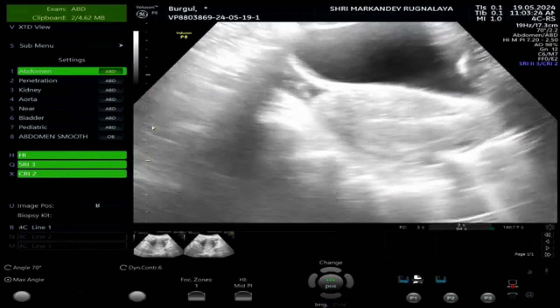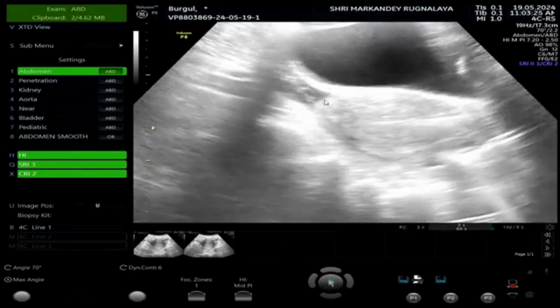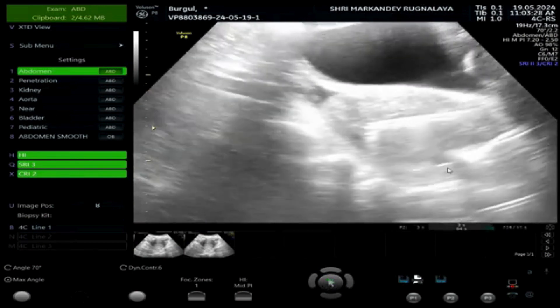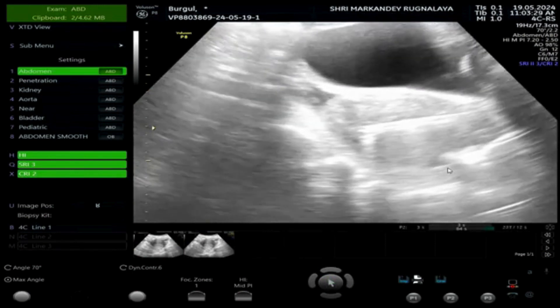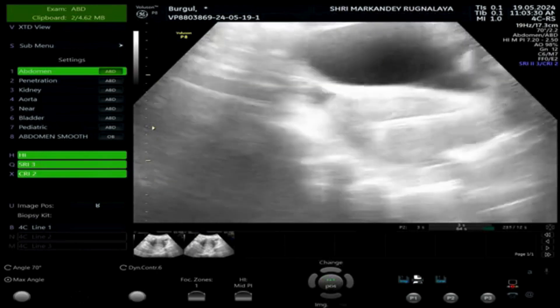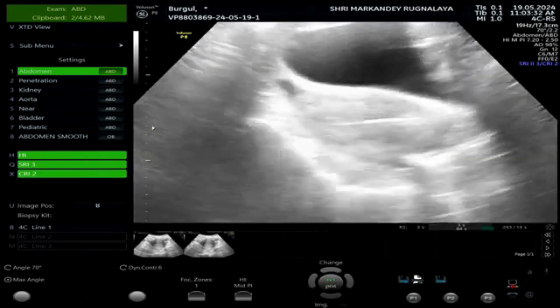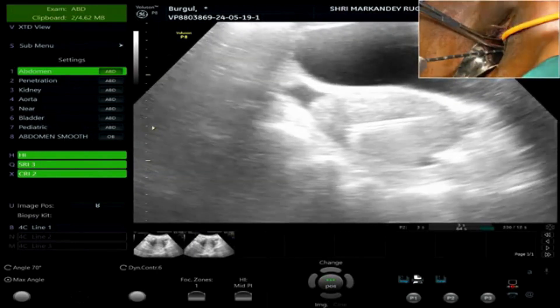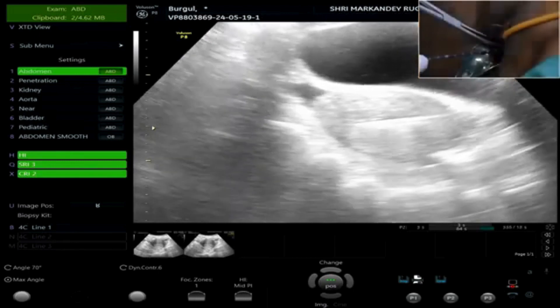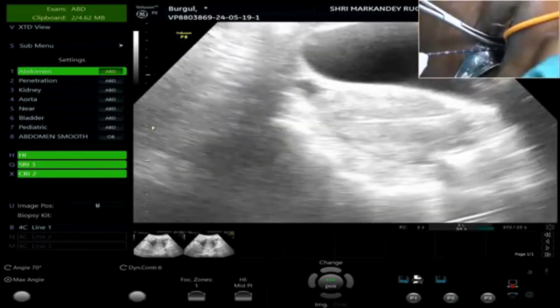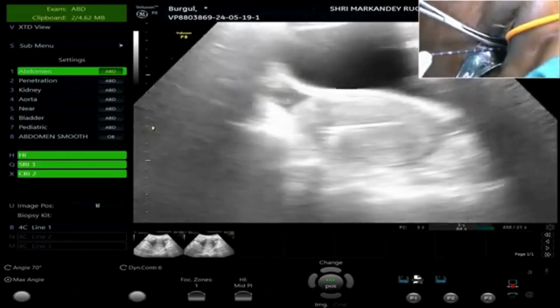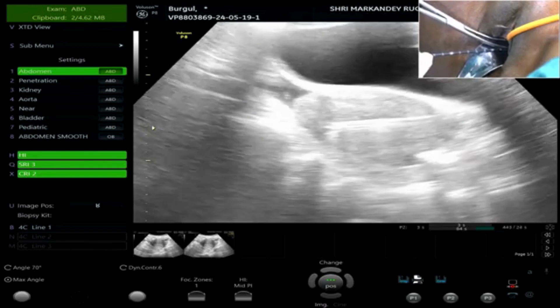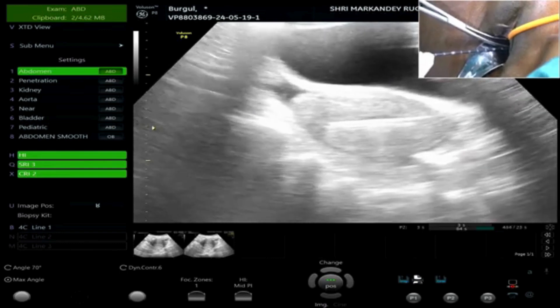I am reaching the fundus. I want to reach my right side of the ostia, so I am bending here. You can see I am on the right side of the ostia. Now I am going to start the fire for one minute here.